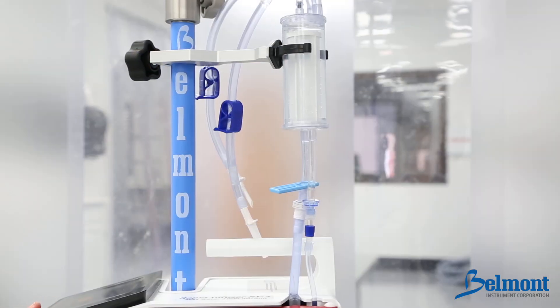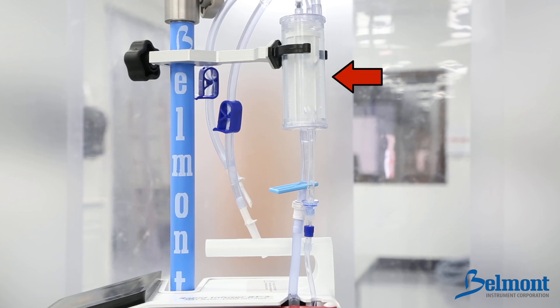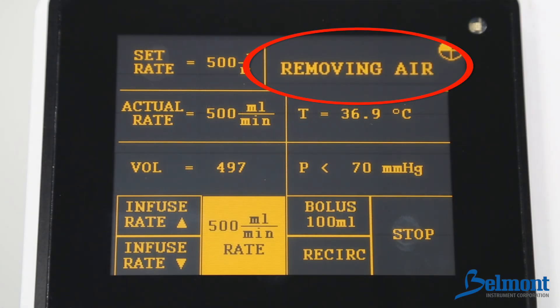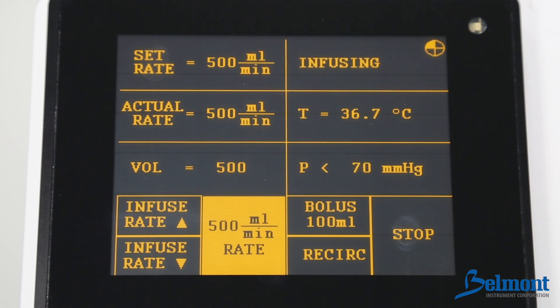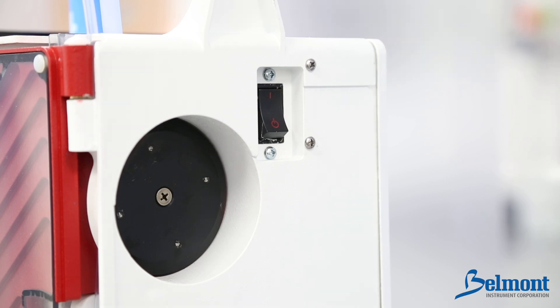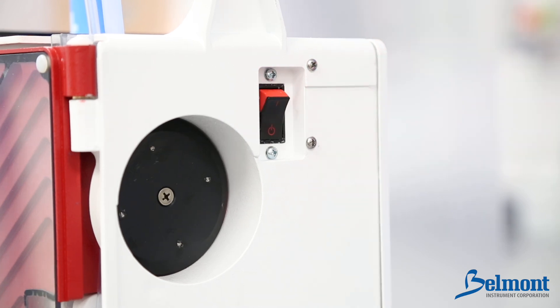As fluids are warmed, gases are formed. The Belmont Rapid Infuser RI2 will trap these gases within the system and automatically purge them into the atmosphere. When this occurs, 'removing air' will be briefly displayed on the screen and you may see bubbles escape through the recirculation or vent line. At the end of the procedure, be sure to disconnect from the patient and power down by turning off the power switch.